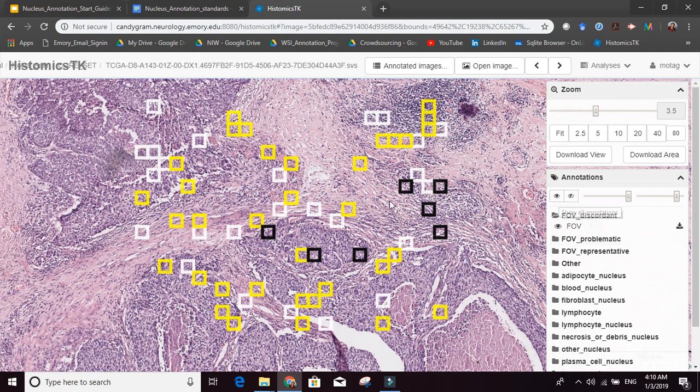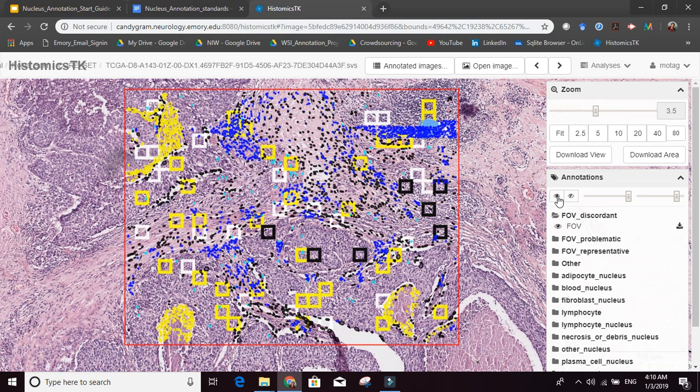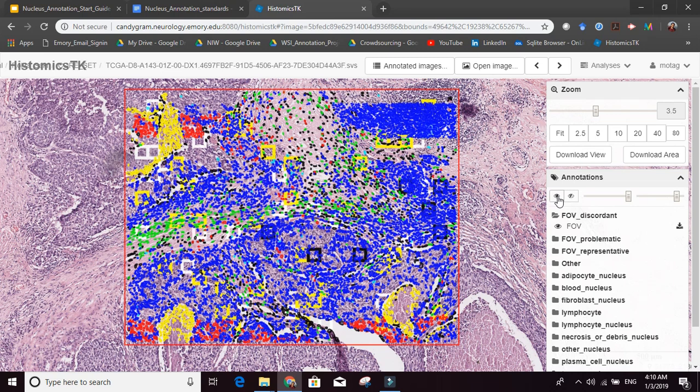Now that you have a feel of where the fields of view are, you can just click on this eye icon, which is going to show everything. After you click it, it's going to take a little while to load. Don't worry, just wait a little bit, because the computer is loading all these annotations that the algorithm has created for you to correct.